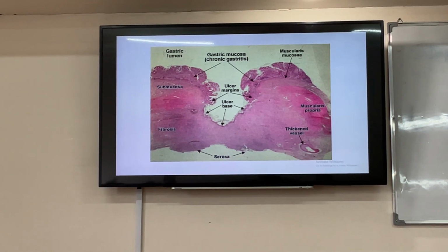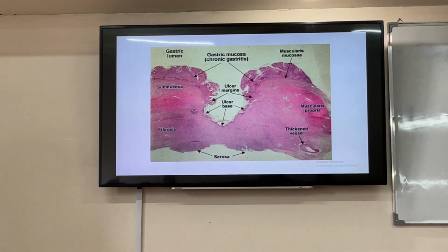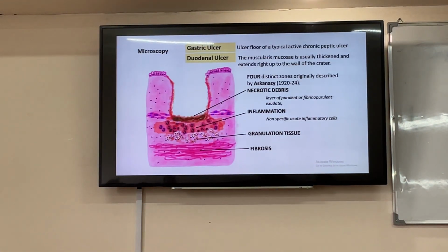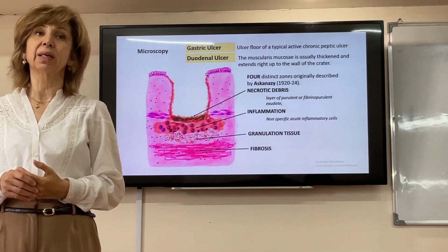Okay? What is this? What is an ulcer? Loss of epithelium. It can be superficial or it can be deep, like this. Now, the second question comes. As we have studied regeneration, etc., okay? Now, in the beginning, maybe I couldn't ask you all these details, but we know something about what?